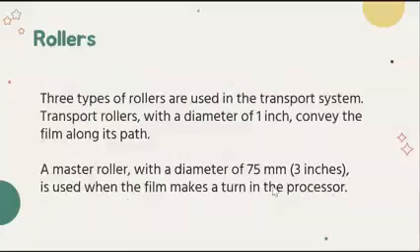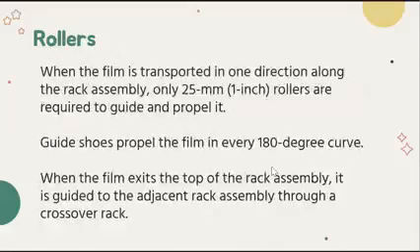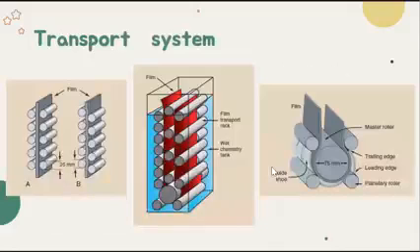Going back. So transport rollers are again positioned opposite to one another in pairs or offset from one another, as I have said a while ago. And the third type of roller is the planetary rollers, and metal or plastic guide shoes are usually positioned around the master roller. So the third type is planetary rollers, and within the transport rollers, we have what we call guide shoes. Okay, later on. Here's a picture of your planetary rollers. So these 4 rollers are what we call the planetary rollers.